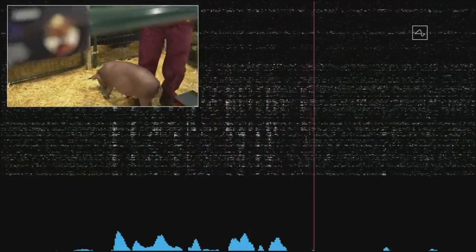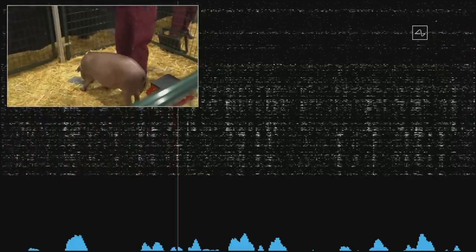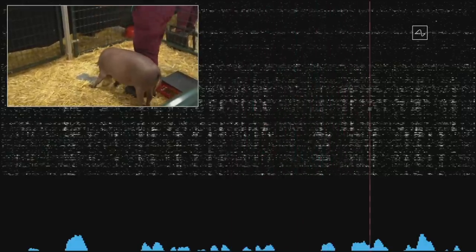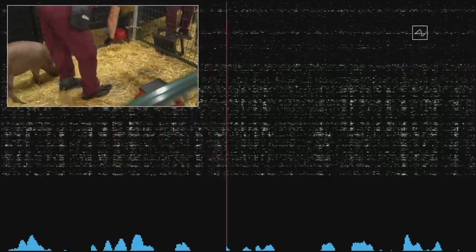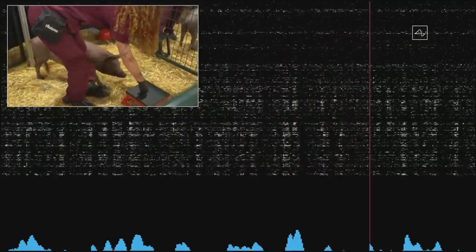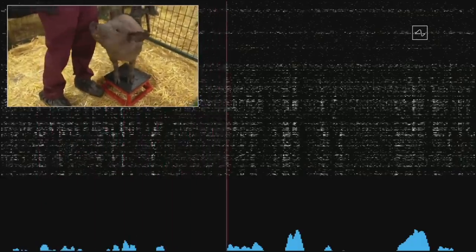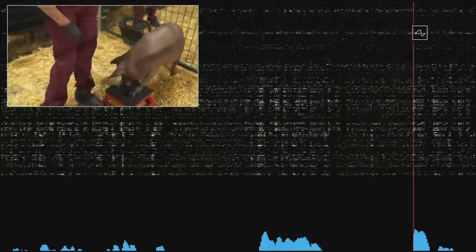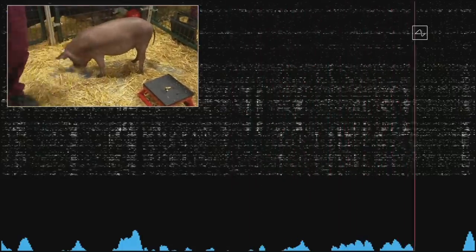This is a high-energy pig. Gautry, thanks for coming out. The beeps you're hearing are real-time signals from the Neuralink in Gautry's head. This Neuralink connects to neurons in her snout. Whenever she snuffles around and touches something with her snout, that sends out neural spikes detected here. On the screen you can see each of the spikes from the 1,024 electrodes. If she snuffles around, touches her snout to the ground, or you feed her some food — pigs love food — the neurons will fire much more than when not touching the snout.